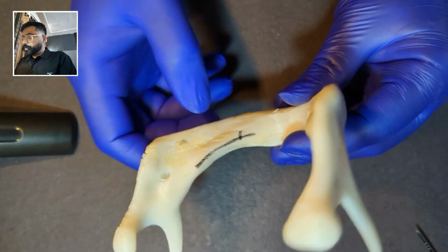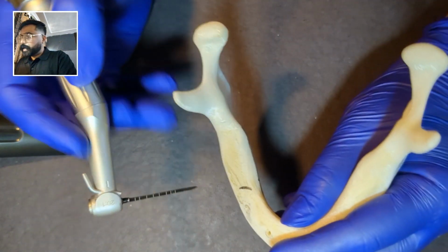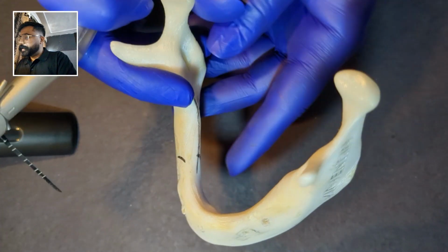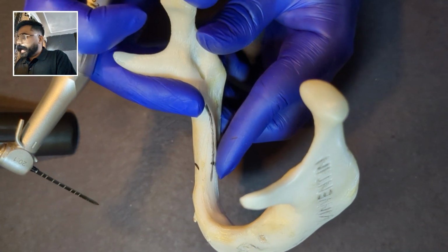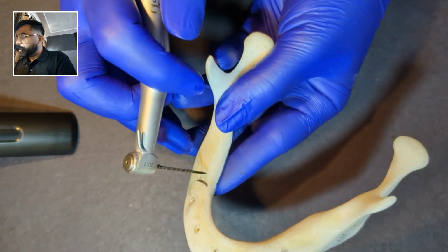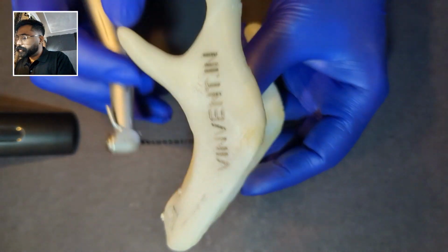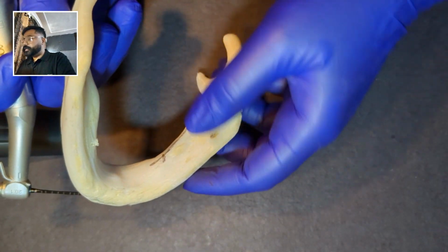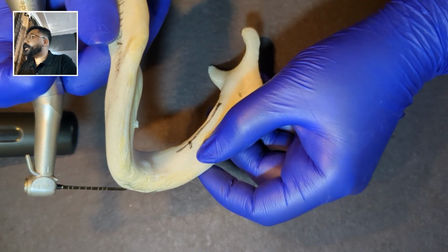So in lingual cortical engagement, what we do is we buccally penetrate. We start the osteotomy from the buccal side, and we place a finger on the lingual side just below the mylohyoid ridge, right? And then we start drilling, aiming the drill towards our finger that is just below the mylohyoid ridge. The rationale behind this is that our nerve, the mandibular nerve, always runs below the mylohyoid ridge.